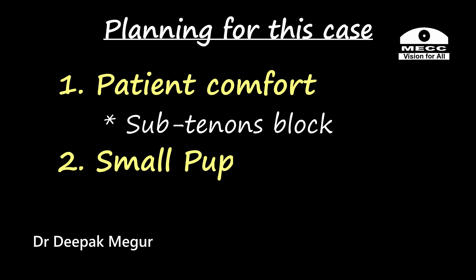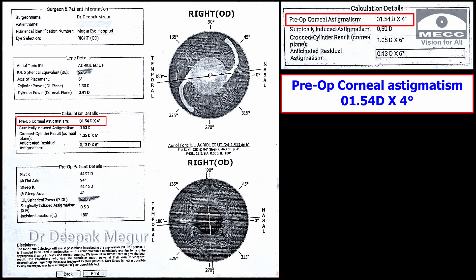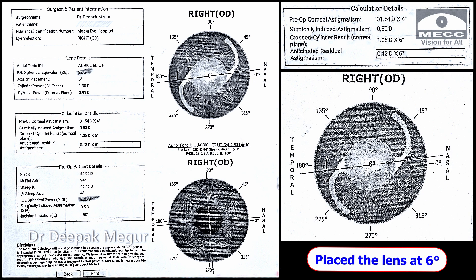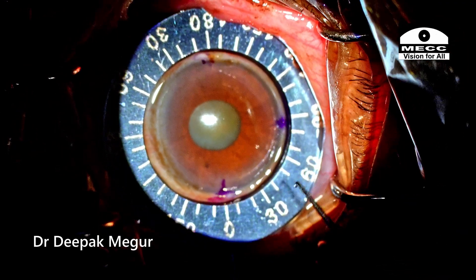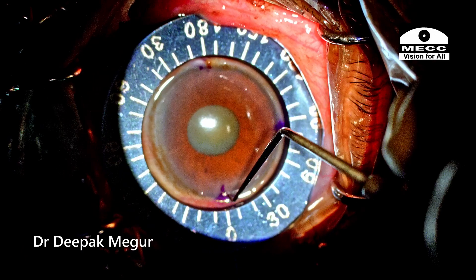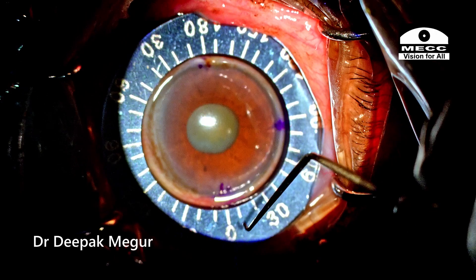The second challenge was much easier to deal with because I just had to manage the small pupil appropriately using pupil expansion devices, so that the toric lens placement and alignment could be seen well. Looking at the toric lens calculation report, we are expected to place the lens at 6 degrees. The post-sub-Tenon's block has been given using a 26G needle with around 2 ml of lignocaine injected, and the reference marking and axis marking have all been done.